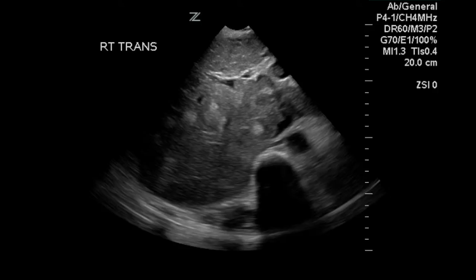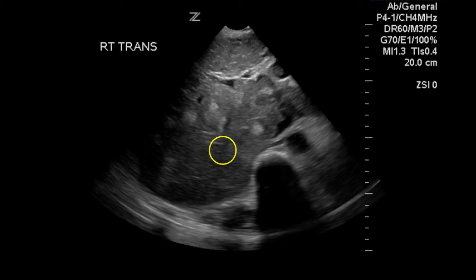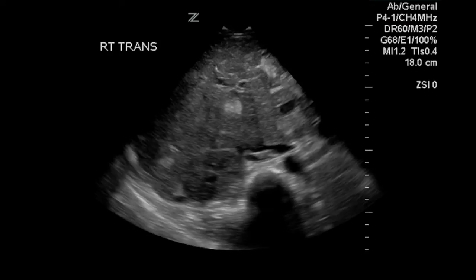This is an image of the liver in transverse, and it is clear that there are multiple echogenic solid nodules in the liver, likely to be metastatic lesions.